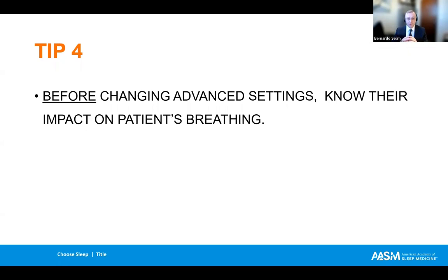If you decide to change these settings, you need to be very aware of how these changes are going to impact your patient. And you need to follow these changes very closely. These are not changes that you make and then just see the patient next year. These are changes that you have to follow very closely in order to see how well the patient interacts with the device. This is what we call synchrony.